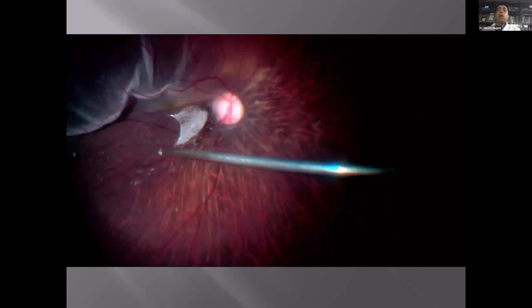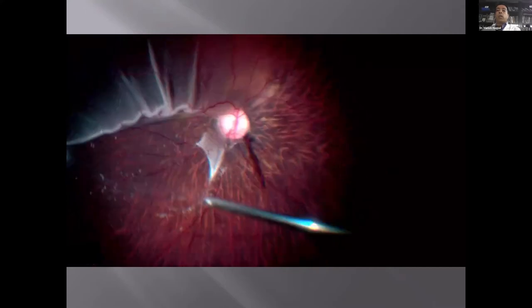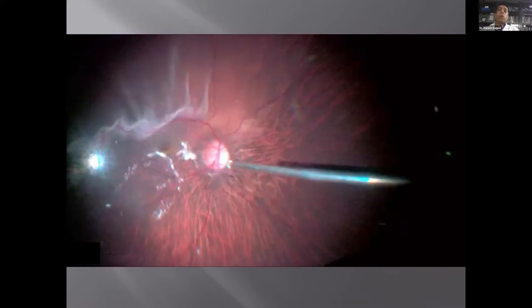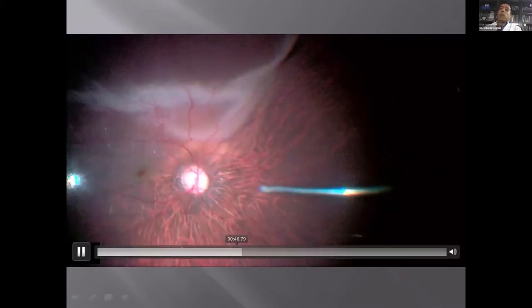This is a myopic case showing a triamcinolone-stained hyaloid. You can see how it peels off gradually using vacuum, with the triamcinolone staining making the process visible. As it keeps separating, you use the cutter and vacuum to clear off the vitreous. As it keeps peeling and expanding, going to the periphery where adhesions are still stronger, near lattice areas it starts shredding, so you trim rather than peel it off — shave at that place and leave it.